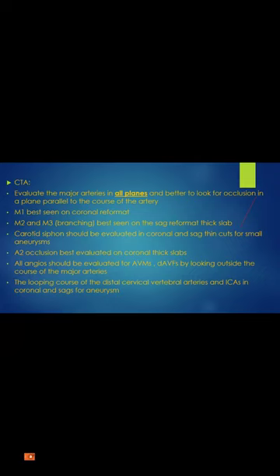For a CT angiogram, you should have a plan, because most people consider CT angiograms as just looking at the vessels in the axial run. That's it. That's CT angiogram, but this is wrong. CT angiograms, usually we do it in the United States.